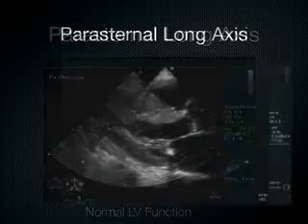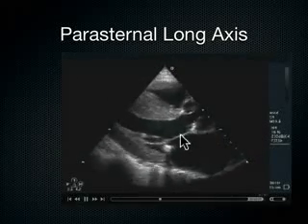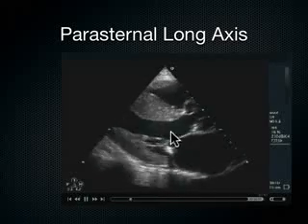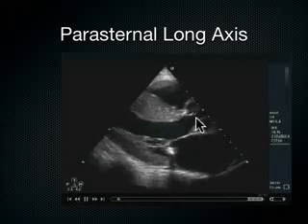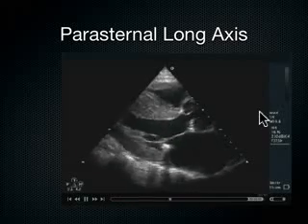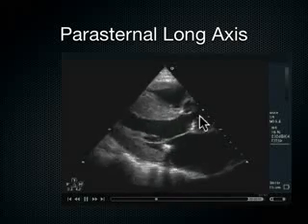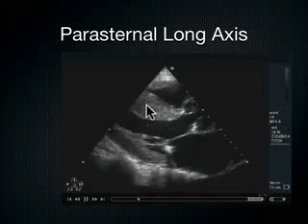Now let's look at another heart and do the same thing. How's that septal leaflet doing? Is it coming up and smacking the interventricular septum? You know what? It gets very close. It's got some good movement. I'm going to say yes. Okay? Is there sequentiality? I don't think so. They seem to both kind of fire at the same time. So I don't see like one then the other. Then I'm going to move on here.